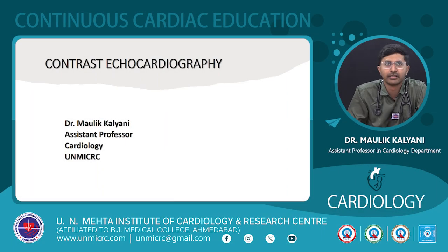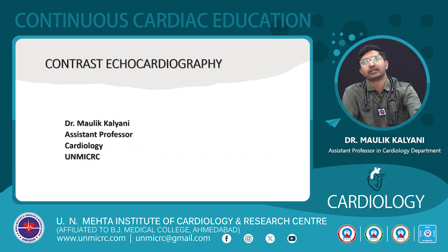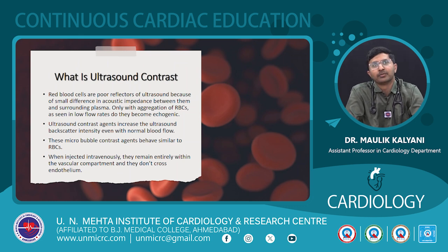Okay, so today the topic for discussion is contrast echocardiography. So what is the contrast and why do we need it? What is ultrasound contrast? Red blood cells are very poor reflectors of ultrasound because the acoustic impedance between the surrounding tissue and RBC is very minimal. So you cannot segregate them, and they do not reflect the ultrasound.